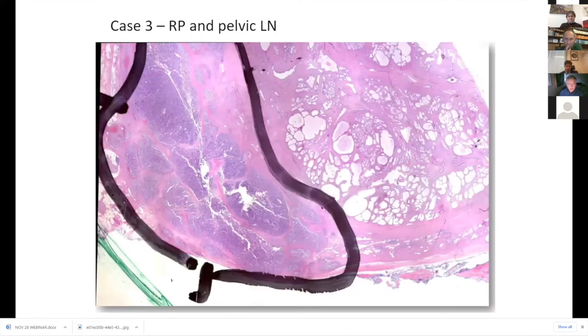And then this is the posterior lateral quadrant section. You can see these benign glands over towards the right-hand side of the screen. It's very cellular, with extraprostatic extension. Even on low power, we can see the extraprostatic fat, which is certainly present still here, but I think there's a considerable bulge of the capsule, and there's definite invasion of the fat as well.